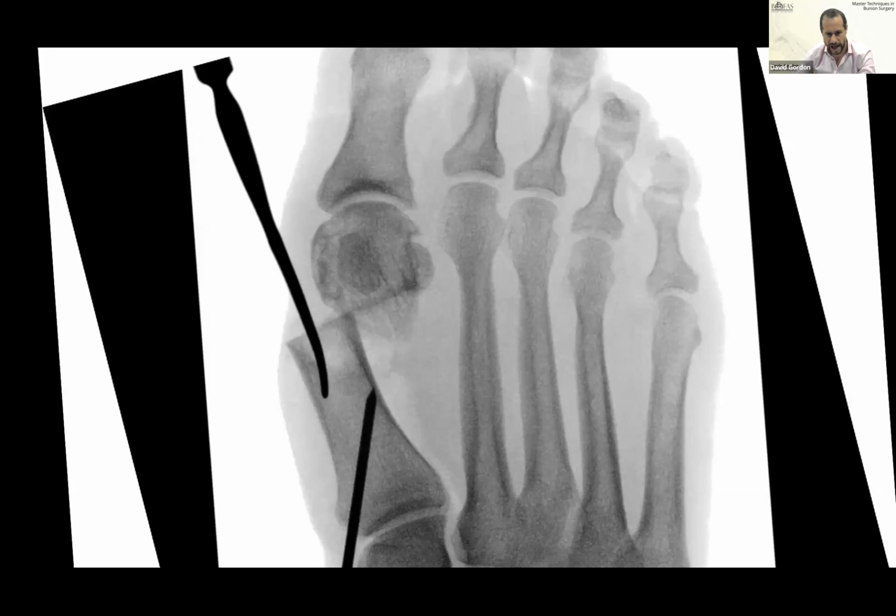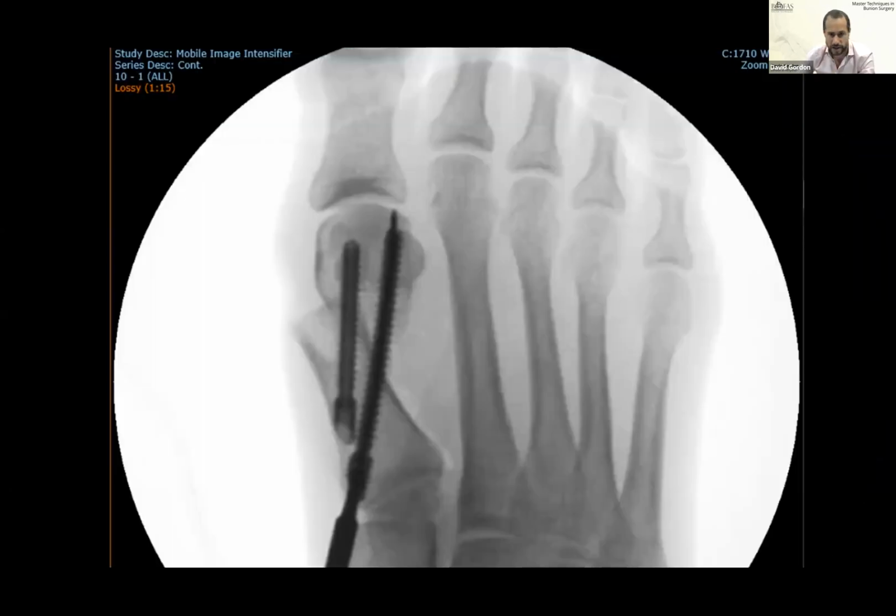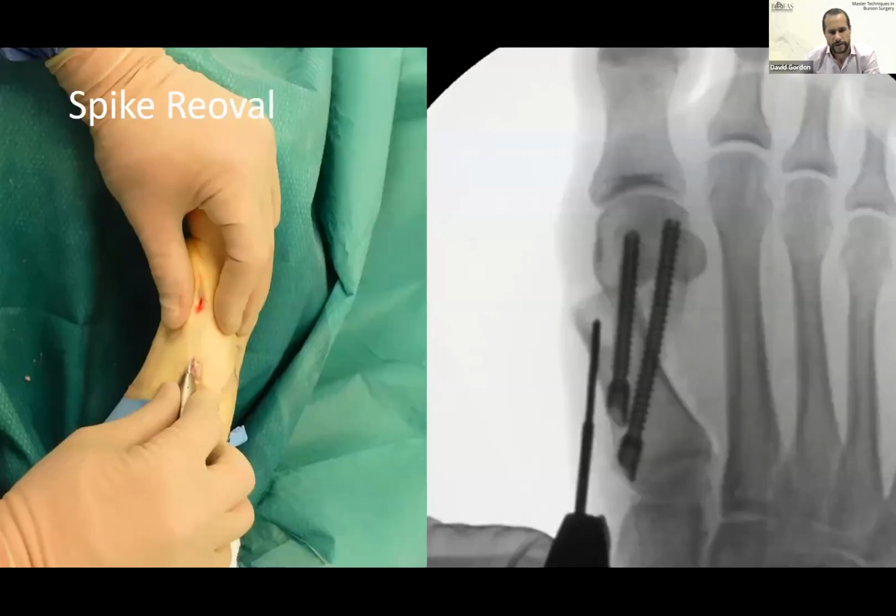And then I have a 2mm K-wire ready to fire through the lateral cortex to gain purchase in the lateral head. And then you fire your second wire, and then the 2mm K-wire will be replaced with a finer wire, so you can drill over that and replace both those wires with 2 screws. So you end up with this configuration of 2 4mm screws. And then you have this spike. So this spike needs to be removed, again with a burr, as pictured.